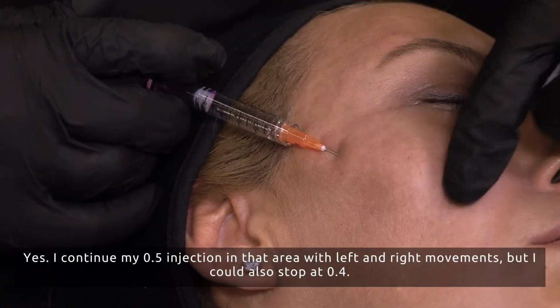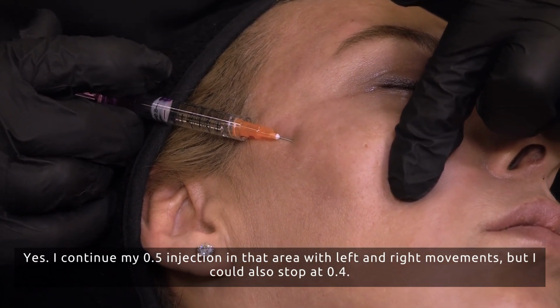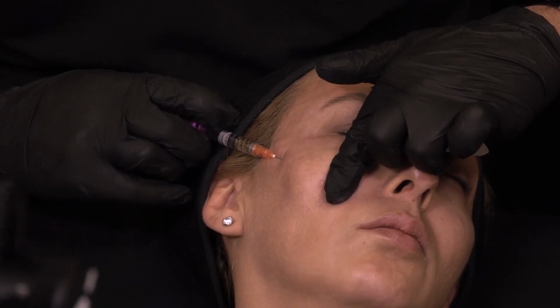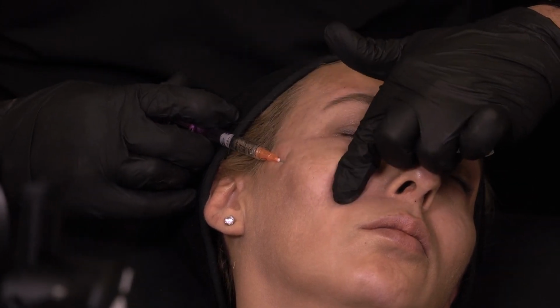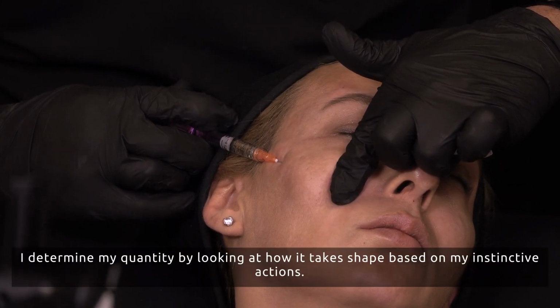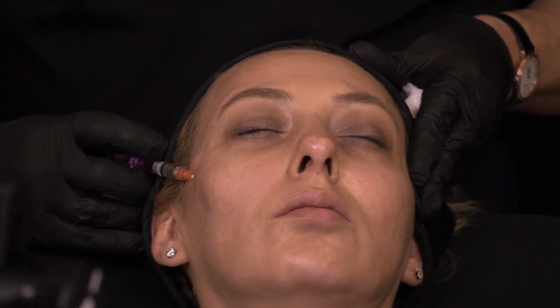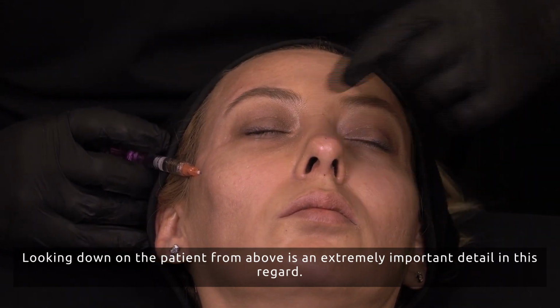Yes, I continue my 0.5 injection in that area with left and right movements, but I could also stop at 0.4. I determine my quantity by looking at how it takes shape based on my instinctive actions. Looking down on the patient from above is an extremely important detail in this regard.